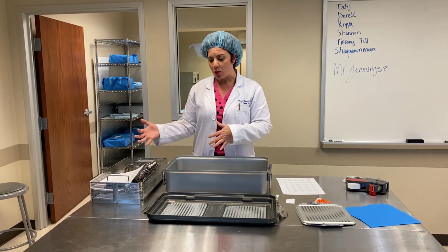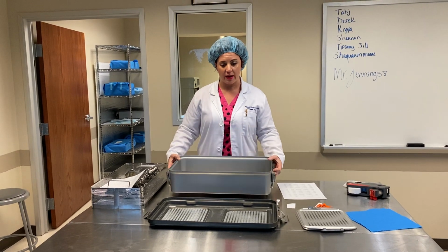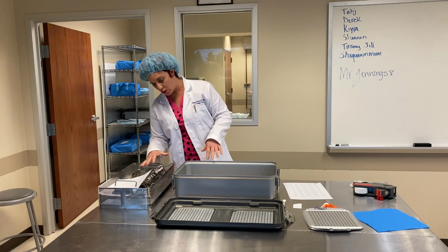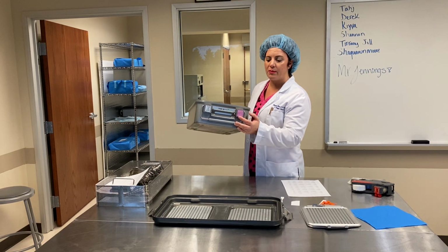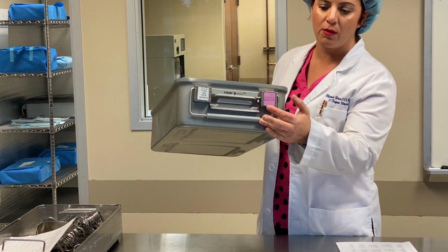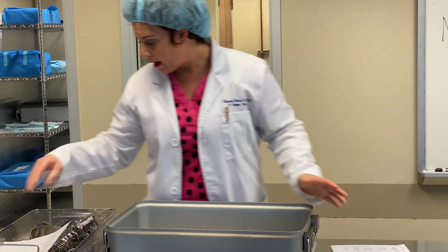At this point, we're looking for a matching pan. You want to make sure that you get the right size pan that matches your tray. This is a major tray. At the hospital, all of these pans are going to be labeled with what type of tray it is. This one says major tray on it right there, so we know we have the correct one.